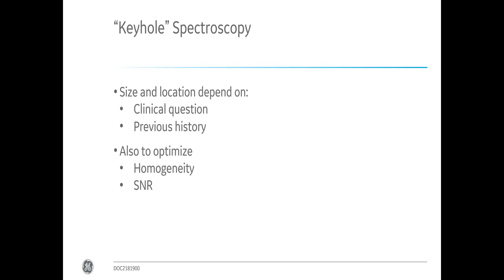Here it really depends on the clinical question and the previous history. And the goal is to optimize for homogeneity and shim as well as SNR.